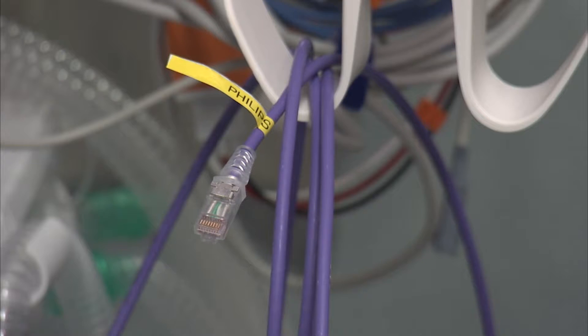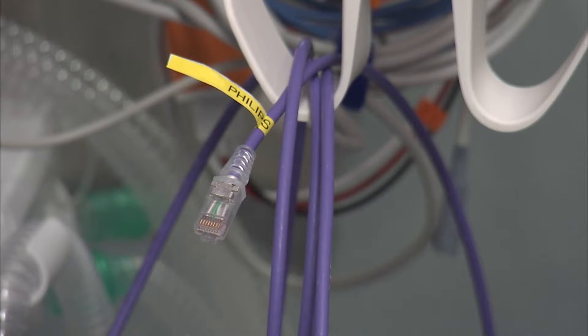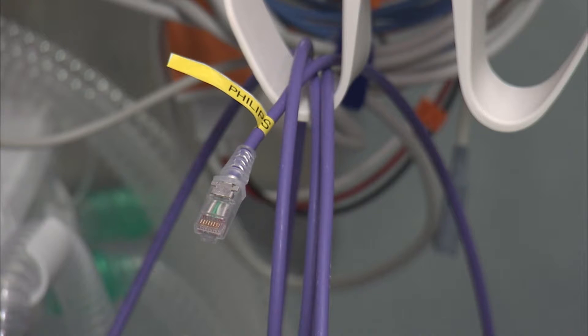To troubleshoot, check your cable connections, the condition of your data cables, and reconnect.